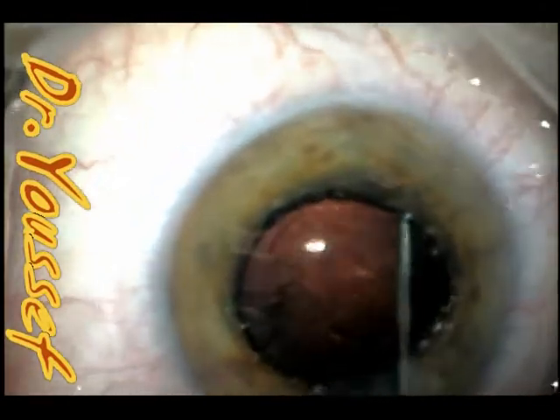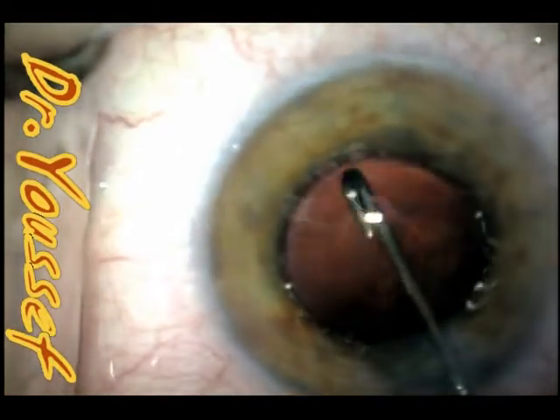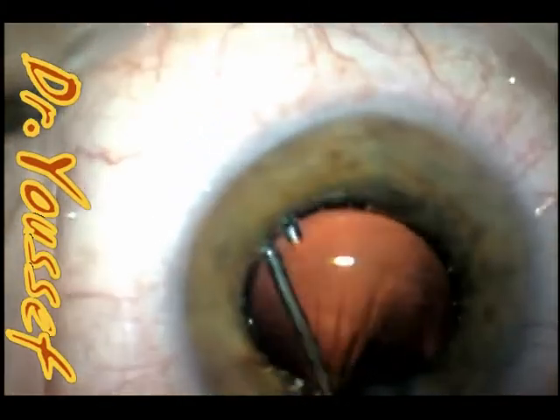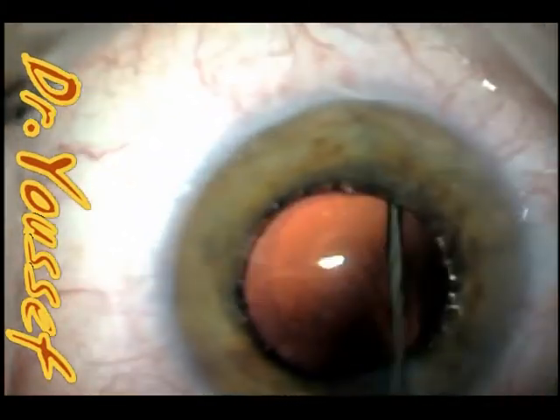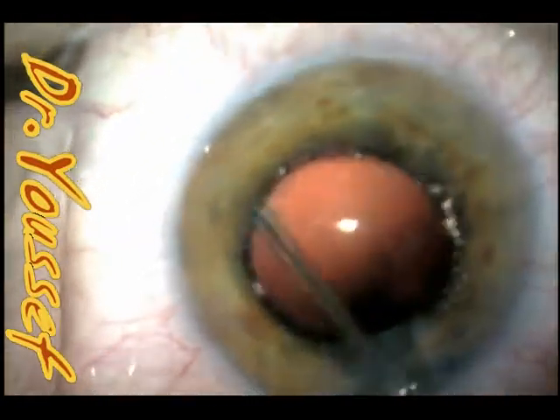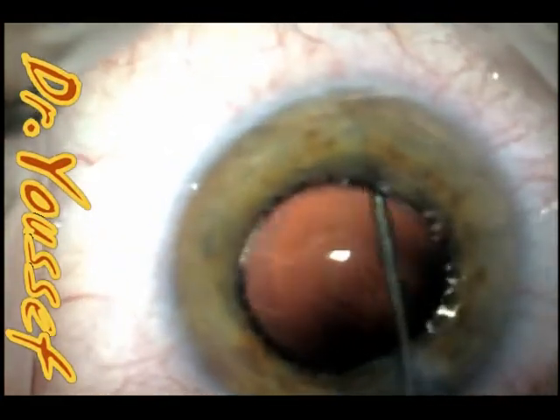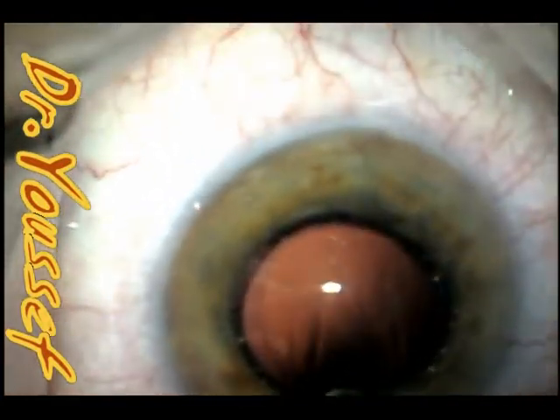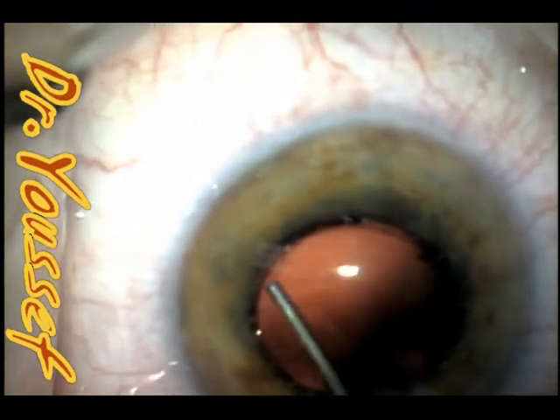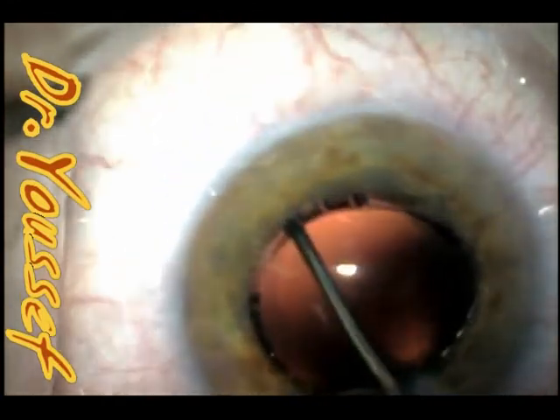A nice thing about the J-cannula here is that you can use it blindly underneath the iris without seeing that area safely. It's very effective and takes about 10 to 15 seconds to clean up the capsule, including areas you can't directly see. This is very important in cases with a small pupil like this. I'm now injecting viscoelastic to prepare for lens implantation.